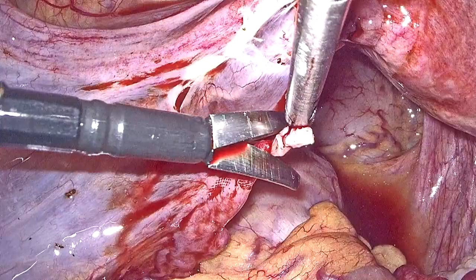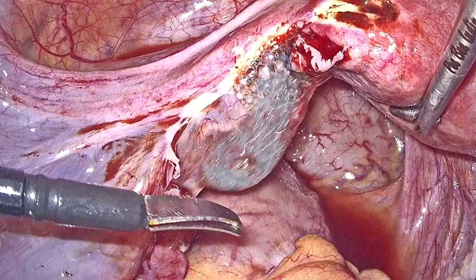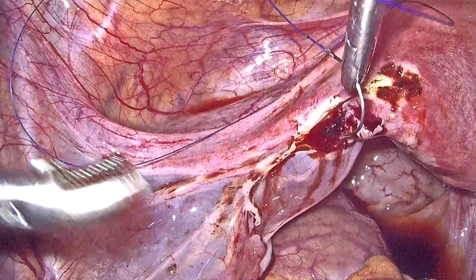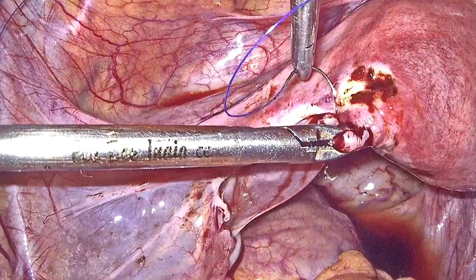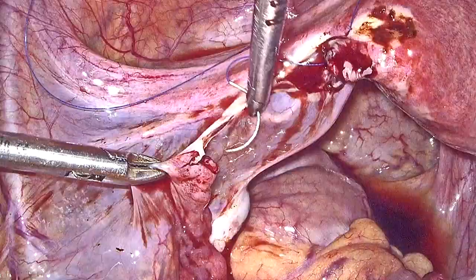Once the edges have been freshened, suturing is typically begun at the level of the mesosalpinx, using prolene sutures. We are currently using a non-absorbable 5-0 prolene suture to suture the mesosalpinx. Once the mesosalpinx has been sutured, it approximates the two cut ends of the stump into close proximity with each other.